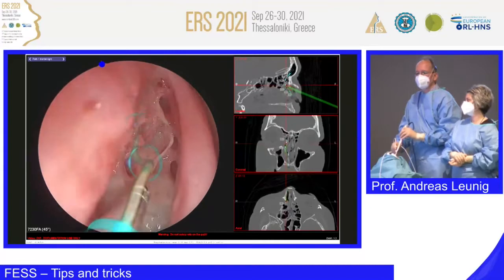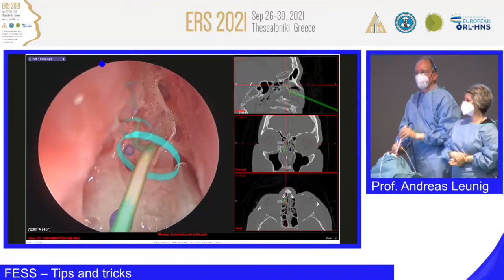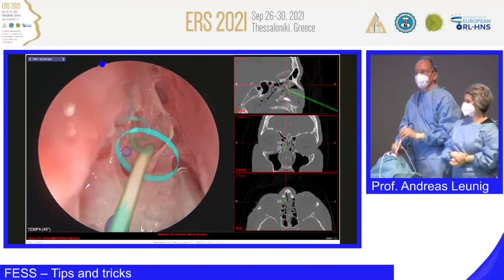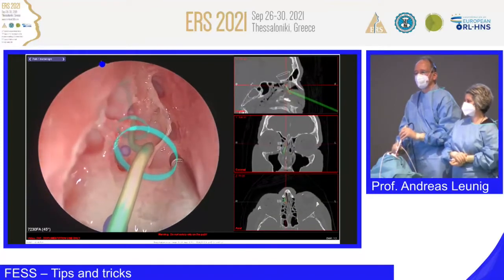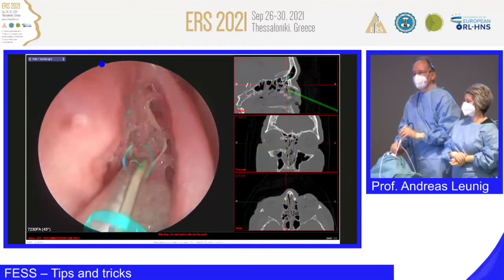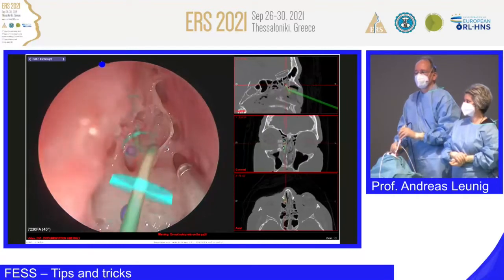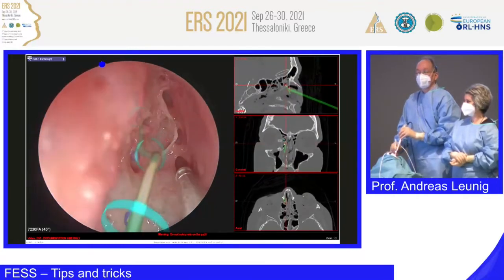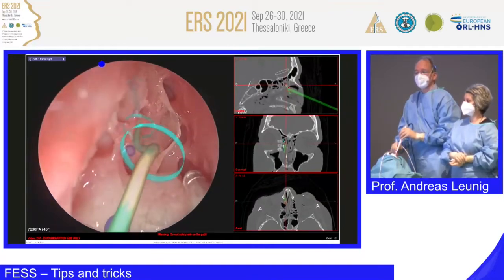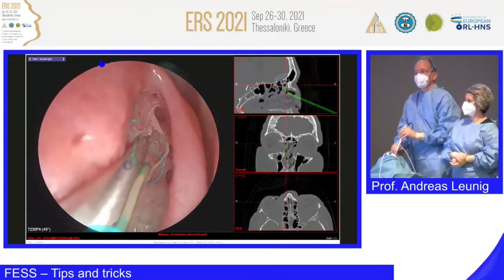There are a lot of openings, clefts here. Can you see here? One is here. And when you follow the top, the CT scan at the top on the right side, you see there's a drainage pathway. Maybe this is a drainage path, it could be. We will see later. There's one opening, there's another one, and here it seems to be a cell. Maybe this is a supra-bulla cell. There's a nice classification by Peter Wormald and expert group. I love this classification. It's named according to the anatomy, so we will see. Yeah, it's nice. I think it's a very nice cadaver.